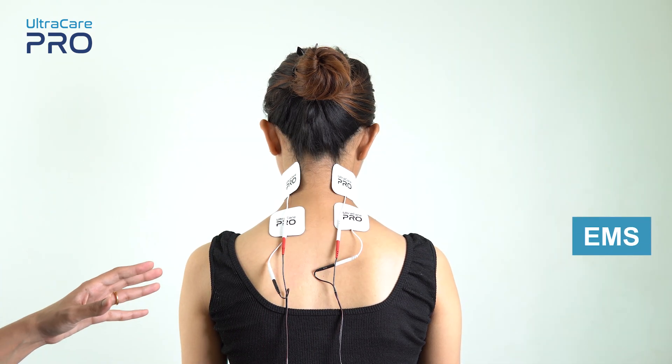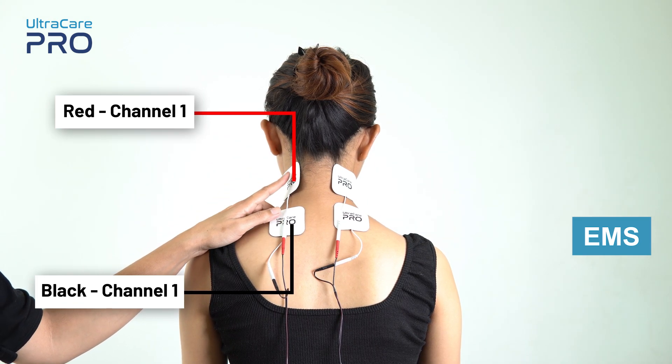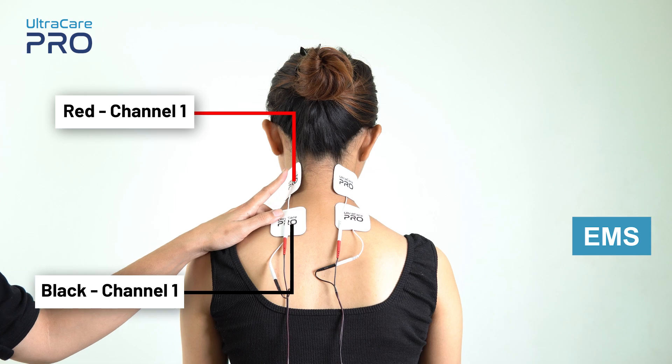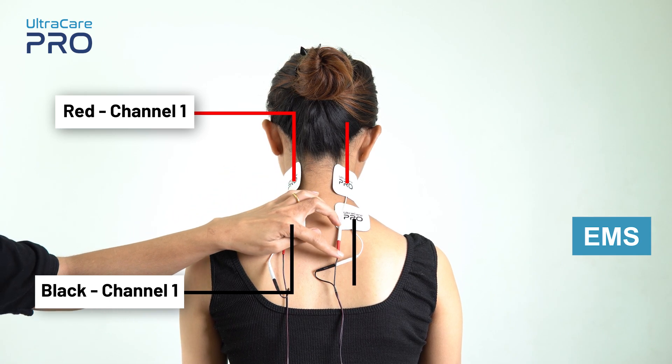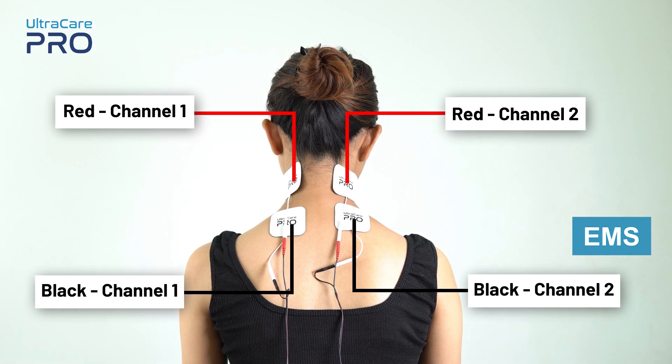For EMS application, place the red and black electrode from channel 1 over the muscle that needs to be stimulated. Similarly, place the red and black electrode from channel 2 on the other side of the neck where the muscle needs to be stimulated.